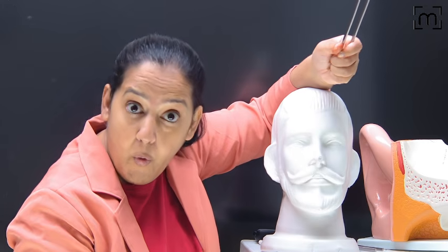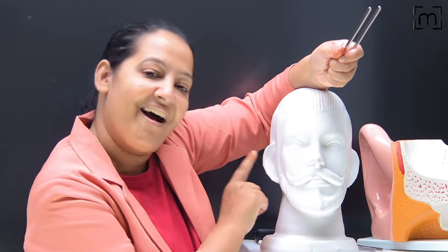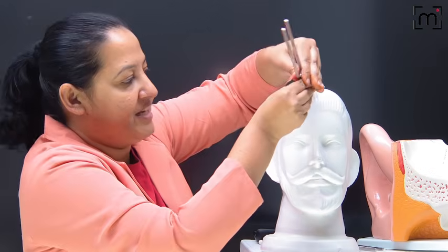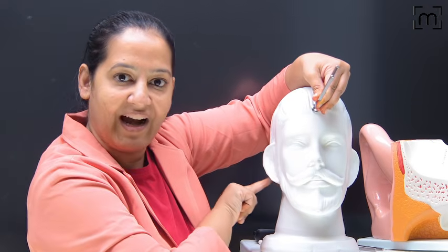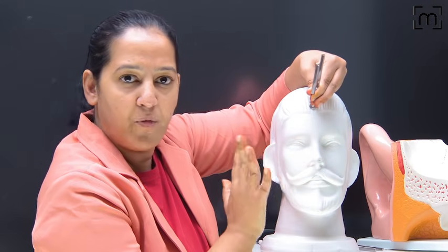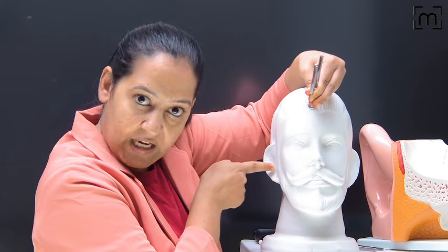But suppose my patient has conductive hearing loss in this ear. Again, I'm performing Weber in front of you. Let's take the tuning fork, activate it and keep it at the vertex. You may think, ma'am, sound waves are going here, activating the mastoid, going ahead. There is no problem in the mastoid. Now there is wax over here, or there is a conductive defect over here.